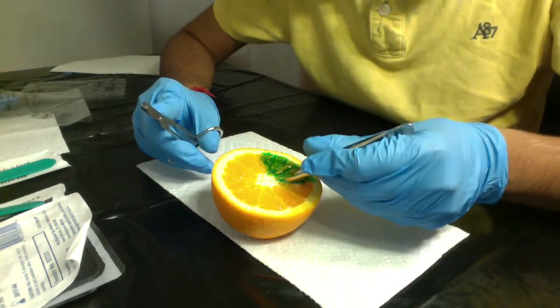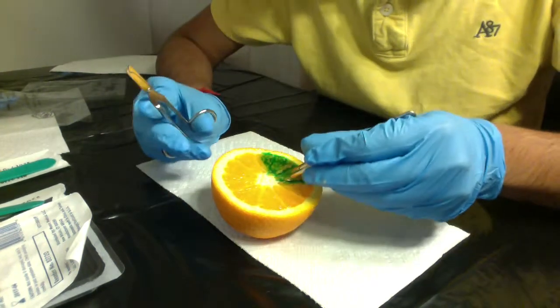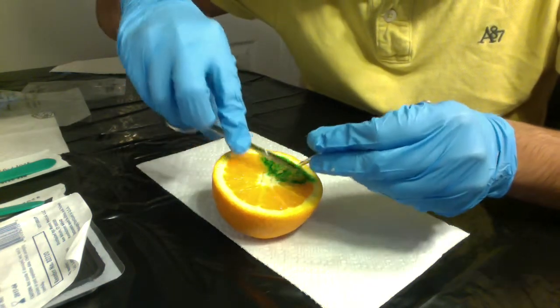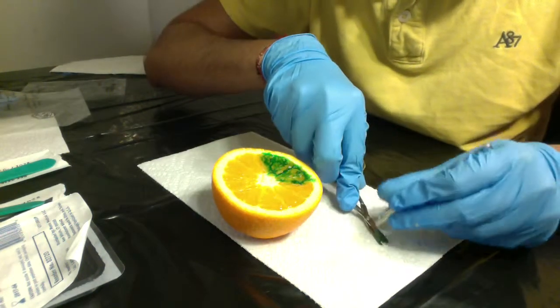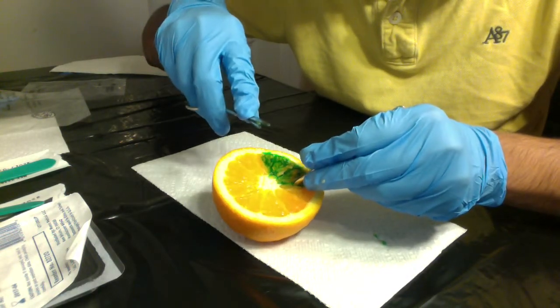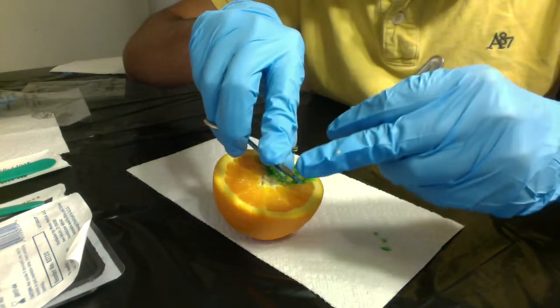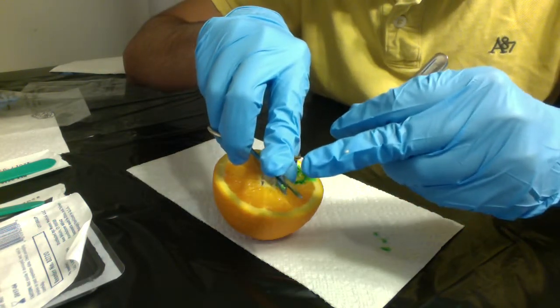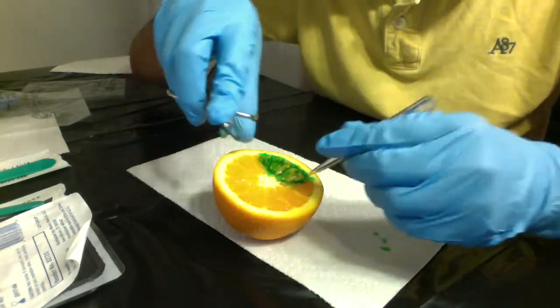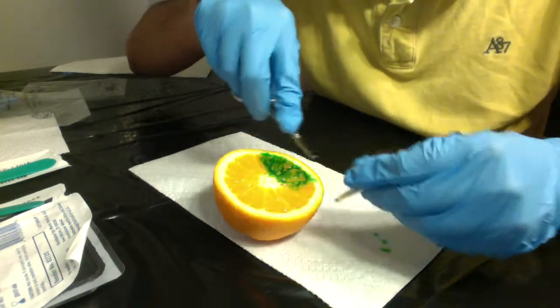So I'm going to try and pick up the necrotic tissues here. For the scissors, I'll be using the inner 1/3 part of the edges so as to get the maximum power out of the scissor.